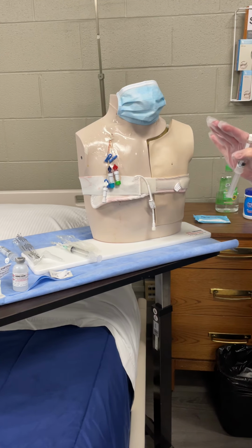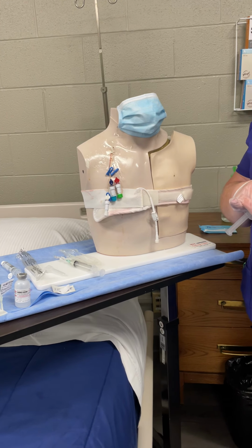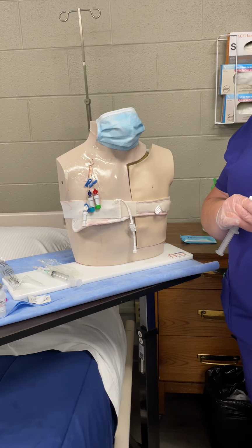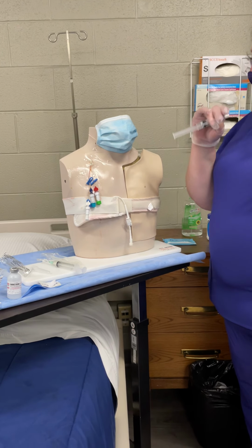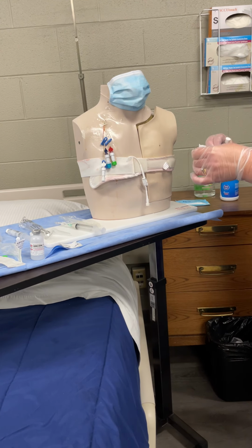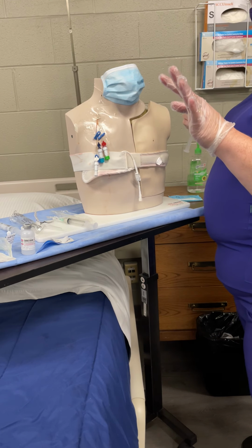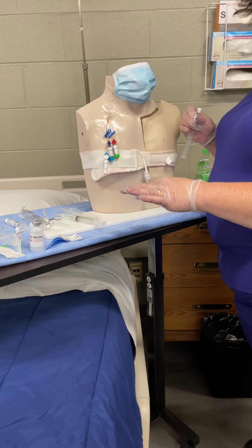Always, always, always, before you give that medicine, I don't care if you did vitals at 6 in the morning and now it's 8, don't go by that 6 o'clock blood pressure. Take a blood pressure right before you give this medicine, because that blood pressure could have dropped in that 2-hour time frame. Does that make sense? Okay, so we're going to say their blood pressure is 140/90. You can either use the blue or the white port.